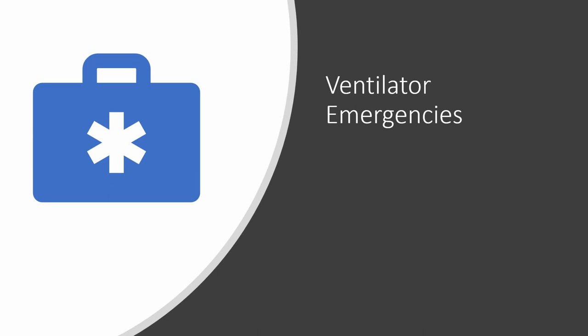What is our mnemonic we use for a patient who's intubated, who starts becoming unstable? We use DOPE. The D stands for displaced tube or circuit. And the ventilator's going to alarm if this happens. O stands for obstruction. So if you get high pressure alarms or low volume alarms, you should suction or consider bronchospasm. Even though the patient's on a ventilator, we still haven't fixed what was the underlying problem. We have relieved some of the ventilation issues or oxygenation issues, but they still have the underlying pathology that we have to treat.